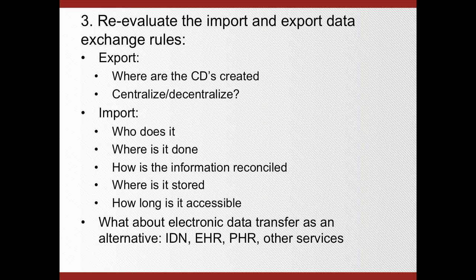At the file room, you start the job and you can tell the patient to pick it up at the file room, where the proper authorization forms and sign-out sheets and things are taken care of. So creating the CDs, or not only the CDs, but in the future some electronic media, other media, you might want to think about, is it centralized or do you decentralize it? Maybe you want to do it at every entrance, like at the front desk or in the ER, or give it to the receptionist. Think about, based on the workflow, where you want to do that.